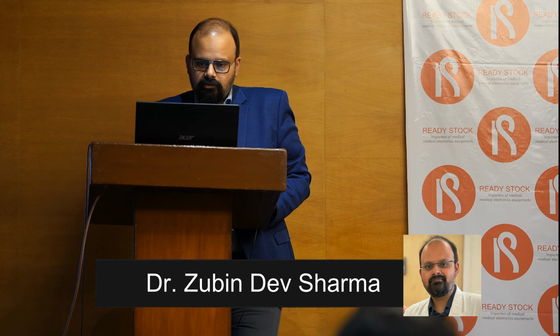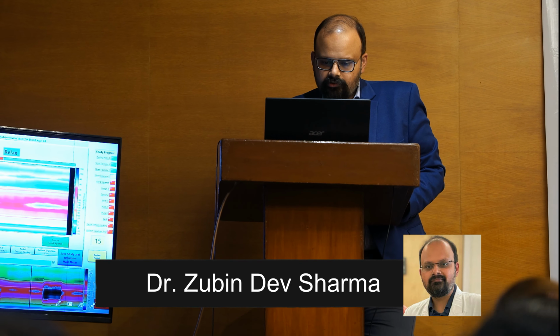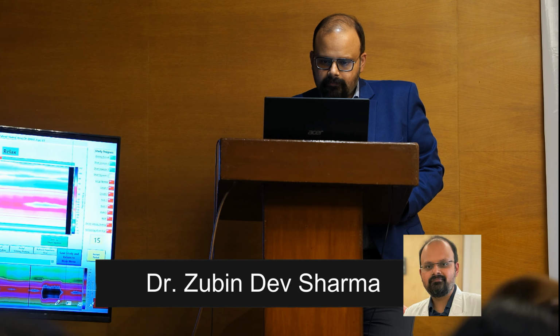I think I did not show the long squeeze here. Did I not show the long squeeze? Yeah, I think I just skipped the long squeeze. So immediately after the squeeze, you will have this. This is the longer squeeze or the long squeeze. How do you explain to the patient? Okay, you start squeezing and don't relax till I say so.